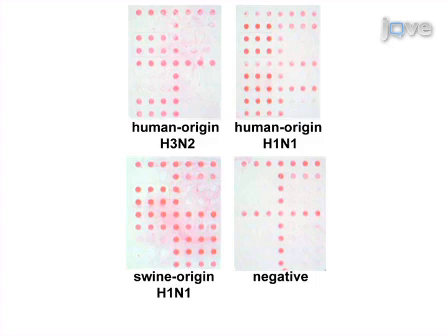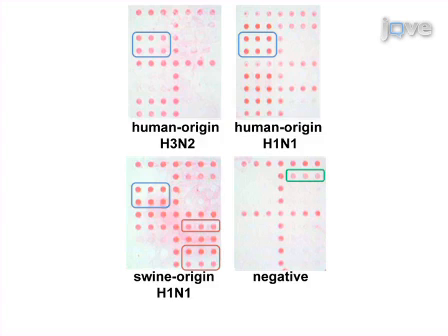Sequences 2 and 3, outlined in blue, produce signal for all of the influenza A subtypes shown, but the sequences outlined in red in the lower right only produce signal for the swine origin H1N1 specimen. The negative specimen shows signal on an internal control sequence, outlined in green, indicating no inhibition or failure of the RT-PCR reaction.